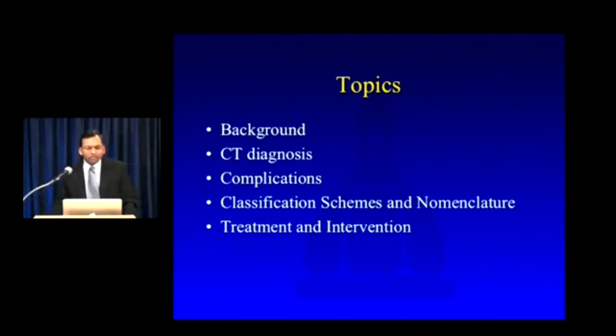But we are going to concentrate most in this lecture on making the diagnosis of pancreatitis on a CT scan, identifying significant complications that I think you as a radiologist should be able to identify, utilizing the most recent classification schemes and nomenclature systems in your own dictations, and then finally, how you can use your dictation to really affect how the patient is treated and intervened upon.